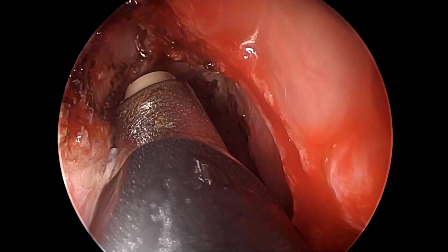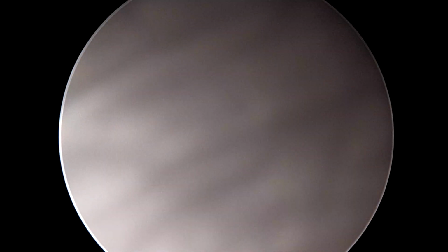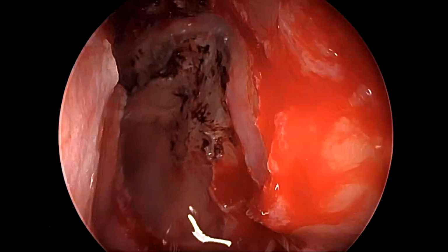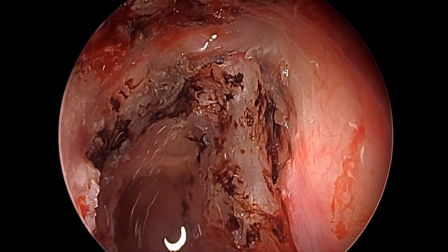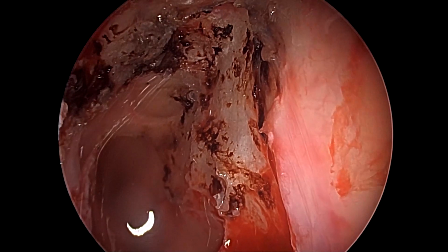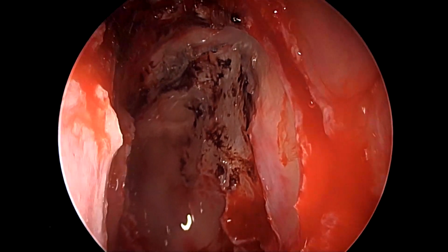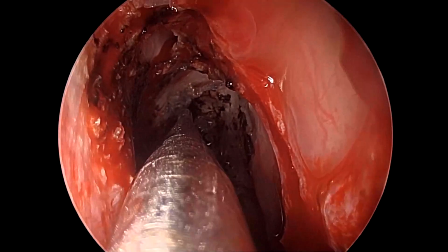So the fundamental part that we always believe in and we propagate here is that the bleeding is not much of a concern here unless it's an intracranial profuse major bleed. Our concern here should always be our surgical field. Our surgical field in all these reconstruction patients is sacrosanct, it's paramount, and I cannot understate or overstate the amount of time you can spend on getting a good surgical field before we resort to actual repair.